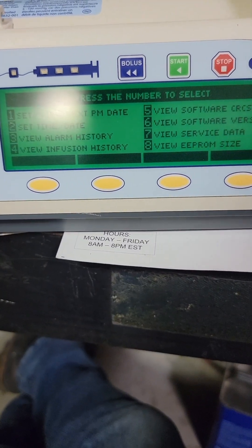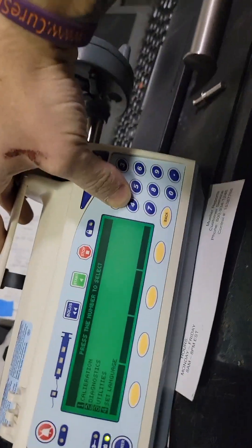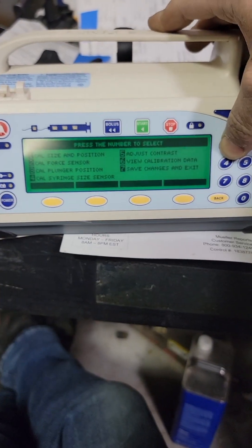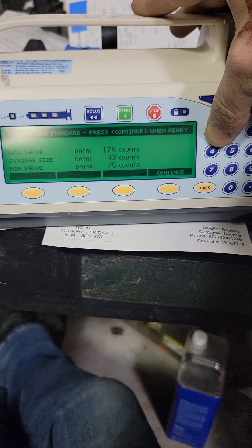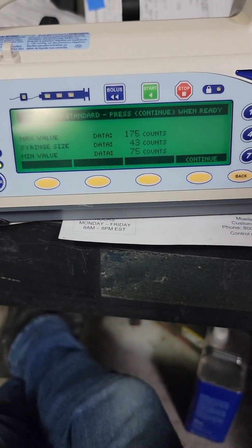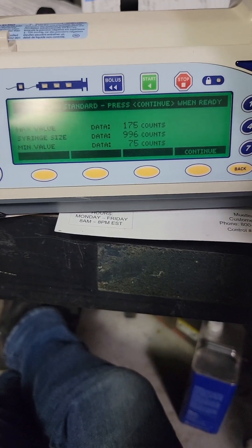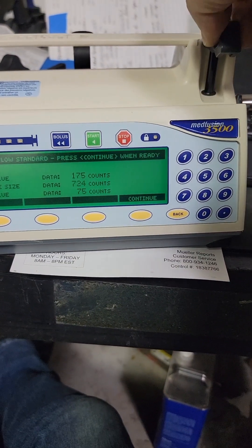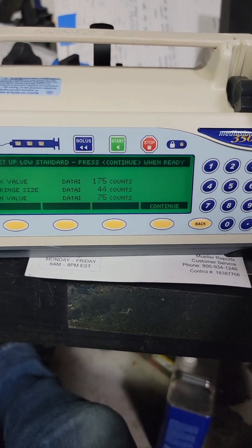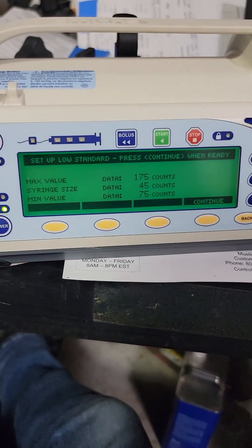Now let's jump into actual calibrations. Calibration one — cal size and position — calibrate syringe size and position. Let's see these numbers. Remove the barrel flange — see that? Syringe size. That is just me moving the barrel flange — see how the number goes up and down. Nothing else has any effect in here.